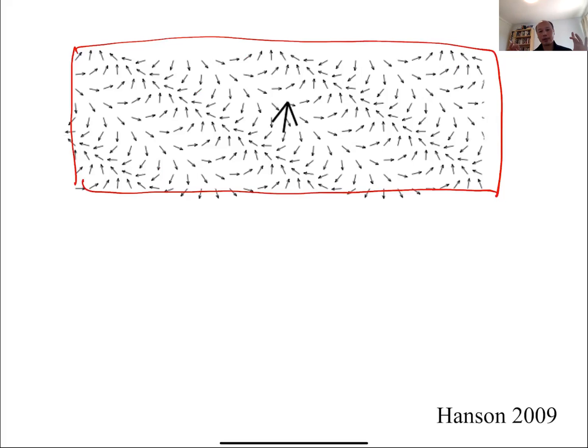So you notice here my object is relatively uniform, and my spatial pattern here is diagonal. Okay, so I'm taking this uniform object and imposing a diagonal pattern on it. Essentially for every spin pointing in this direction, I can find a spin pointing in the opposite direction. So if I think about adding up all these spins, doing a vector sum, I'm going to end up with a total sum that's relatively small, saying that this diagonal pattern isn't really a very good match for my uniform object.